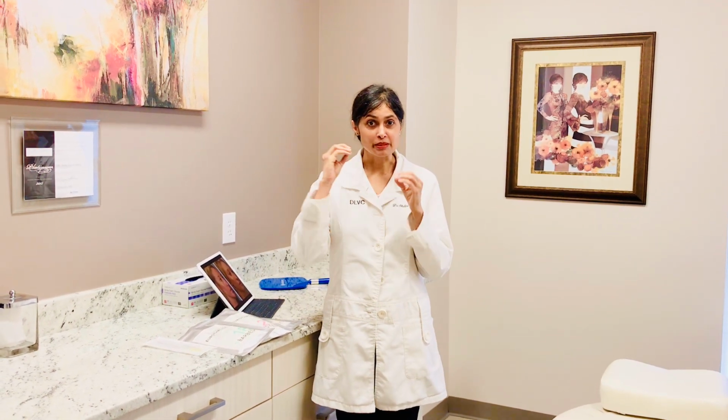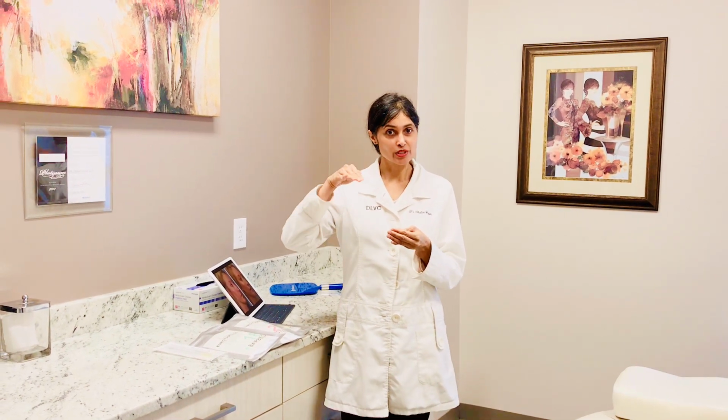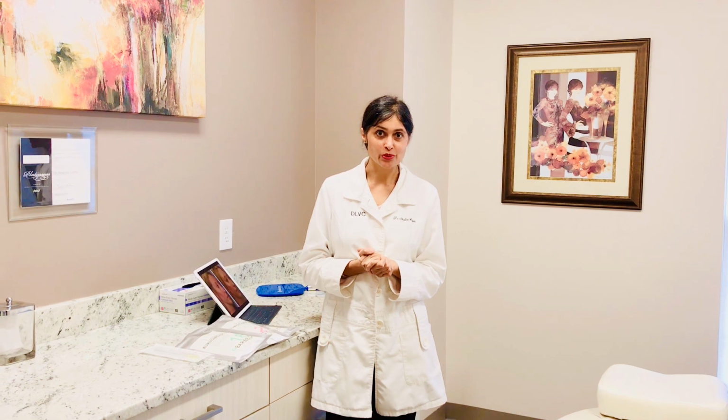Occasionally we'll see a little dimple form in the skin if the thread is not put into the right planes, and that of course is very important and requires experience in terms of placement of the thread so that it goes into the right plane and comes out nice and smooth and gives a nice lifted effect without being choppy appearing. And then you can sometimes get a little bit of bunching in the skin. All of these can be easily corrected with a little bit of manipulation. And like I said, the threads do dissolve on their own with time. We have not seen any allergic reactions or any problems with the threads.